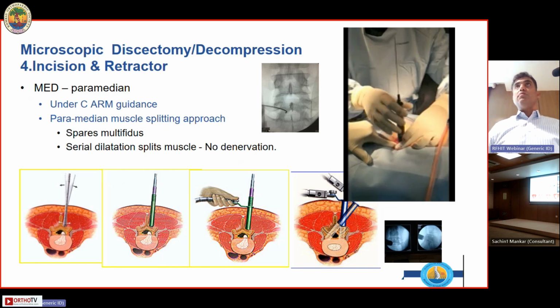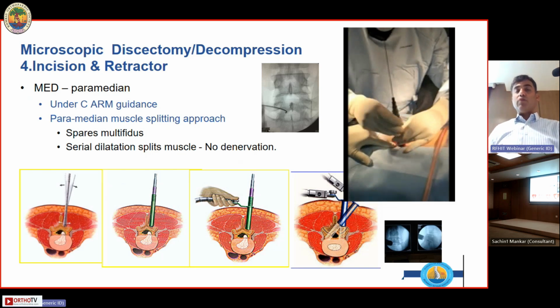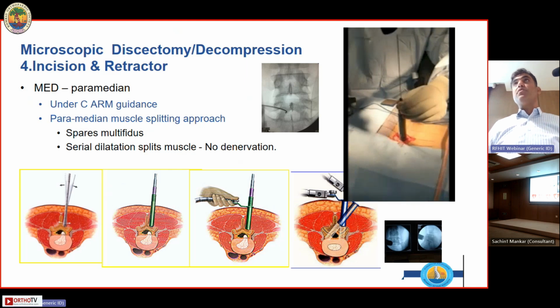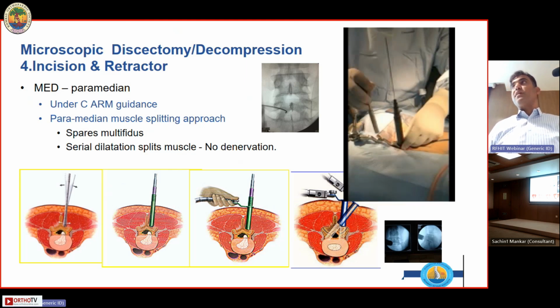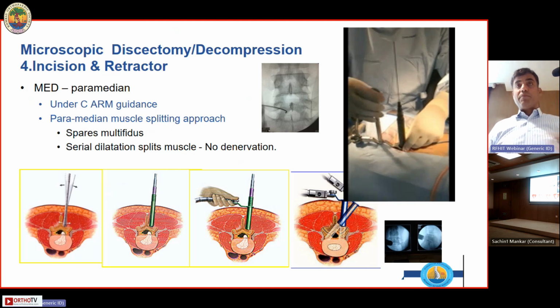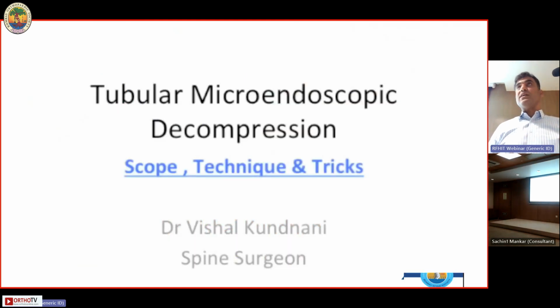You directly land on the bone out there and do the same surgery that we did out there. I generally use a 16 millimeter tube, but when we started, we began with a 22 millimeter tube, and the depth can vary depending on the depth of the patient's back to the bone distance. And the advantages are plenty.